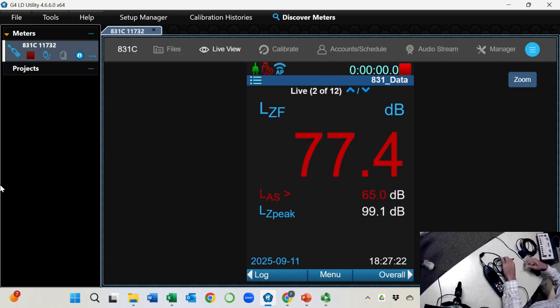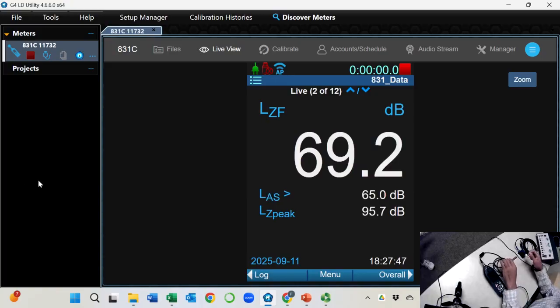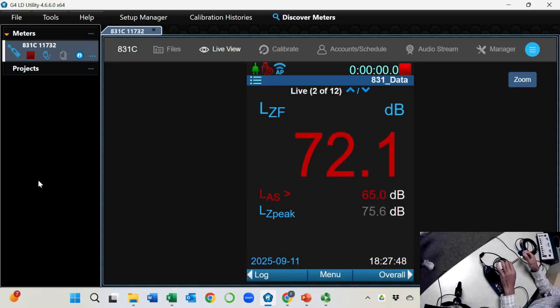Insert tip? Okay. Yeah. That's a good beginning. I have insert tips. So we will need this. Good job, Bree. We will need this because it's related to that. We need the insert ear tip to calibrate, but still doesn't fit, right?